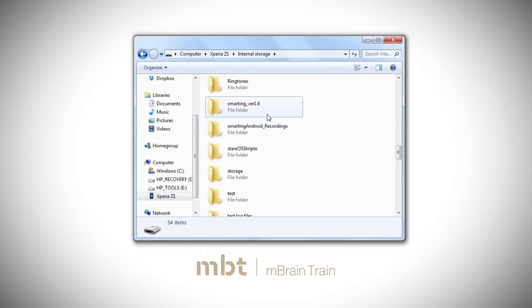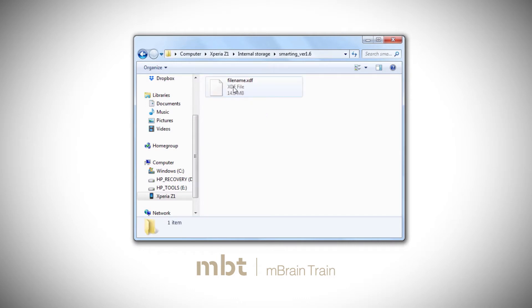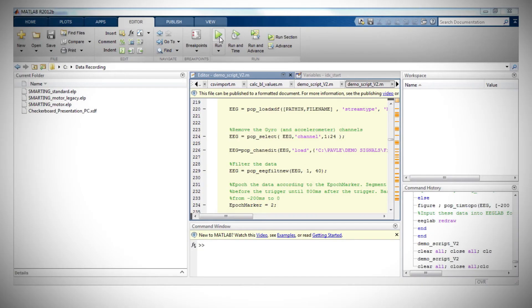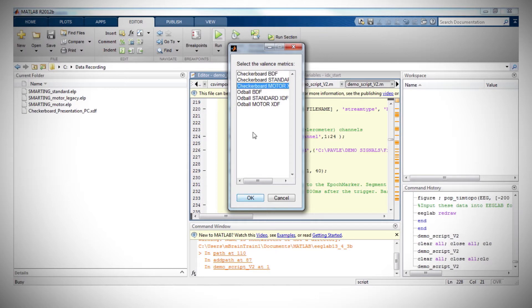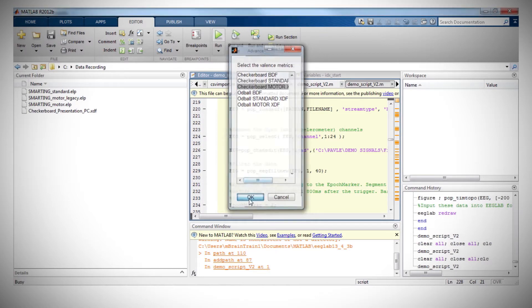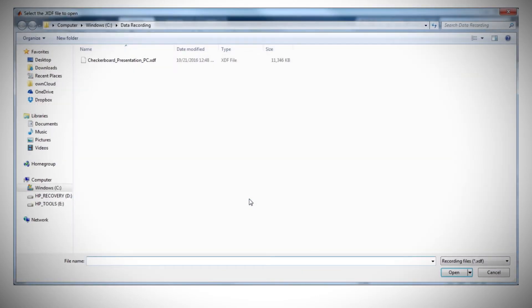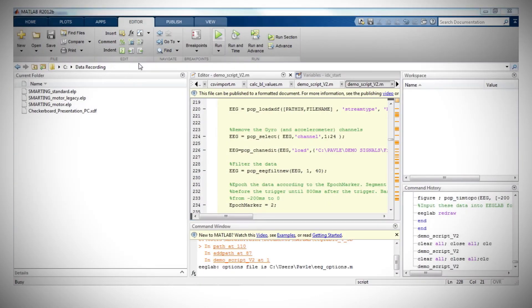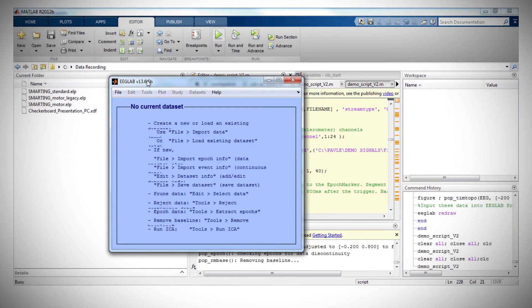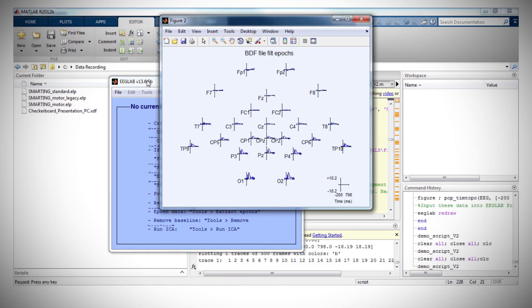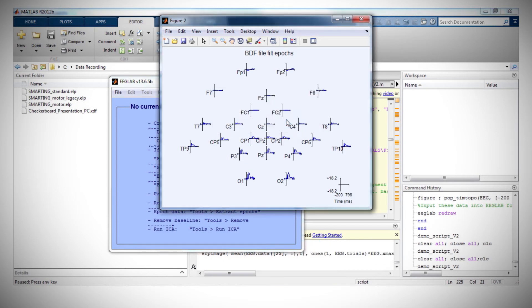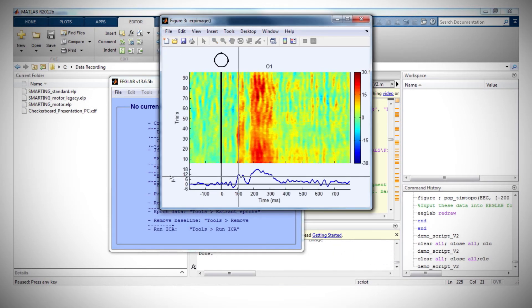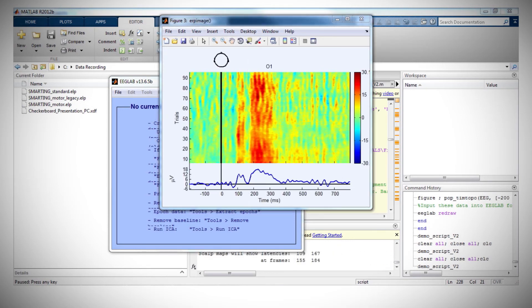The data can be processed in EEGLab in MATLAB or any other software that supports BDF or XDF file format. Here we show an example of processing the data in the EEGLab Toolbox, where you can see the results of the checkerboard task and the visual component P1 in the occipital channels.